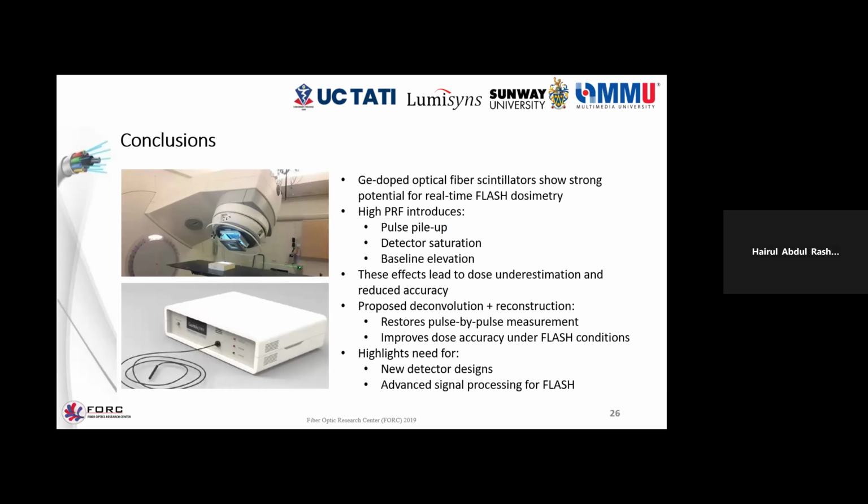So in conclusion, we have tested our germanium-doped optical fiber scintillators for analysis, and it has shown strong potential for real-time FLASH dosimetry. Nonetheless, we've observed at high PRF, pulse pile-up, detector saturation, and baseline elevation.